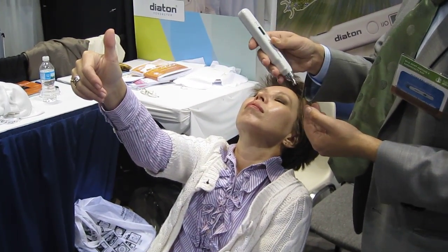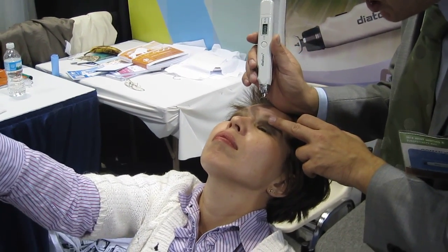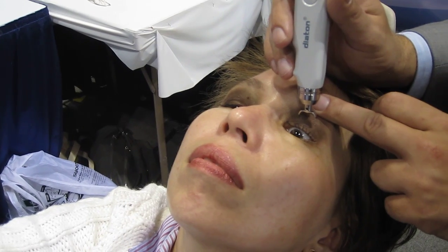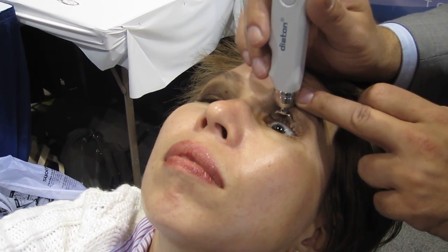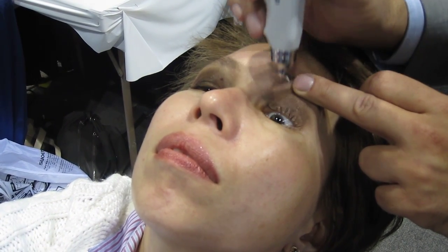Get the tonometer into the ready position. Gently use the edge of your palm to support on the patient's forehead. Gently pull on the eyelid as it naturally opens, making sure that the edge of the lid is above the edge of the limbus and does not slide onto the cornea. Place the tip of the tonometer right over the tarsal plate and gently release downwards.